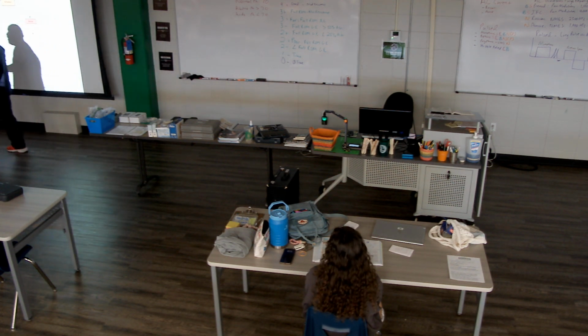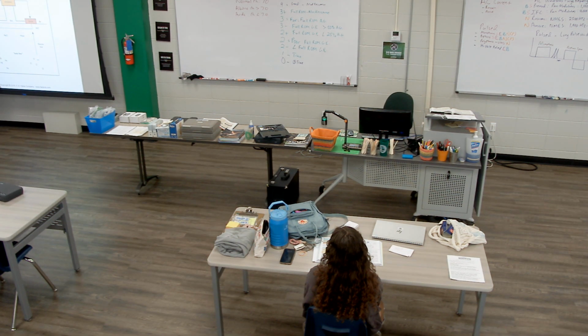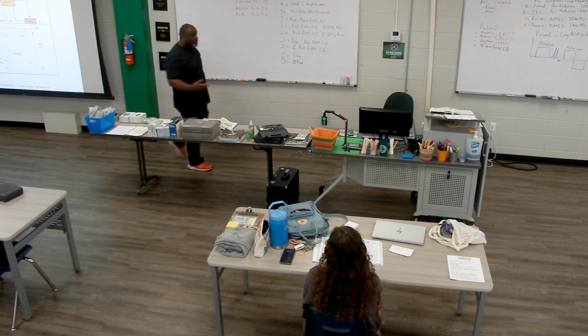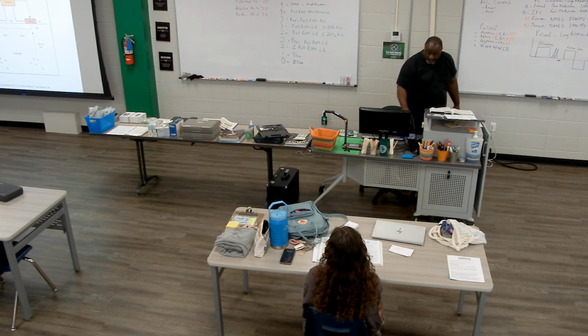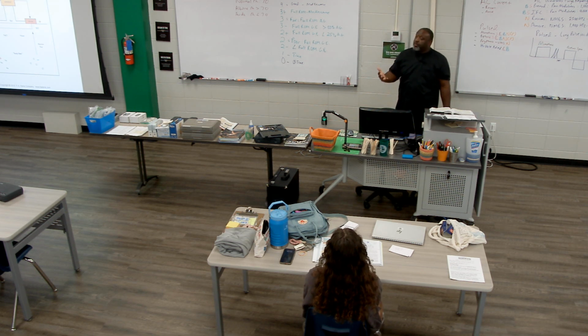They may be coming to therapy with that, but the device is not something they should be using while they're in therapy. They should be doing it at home under the prescription of the physician. Okay, so those are bone stimulators. That's a type of direct current. We don't use bone stimulators as a part of what we do.